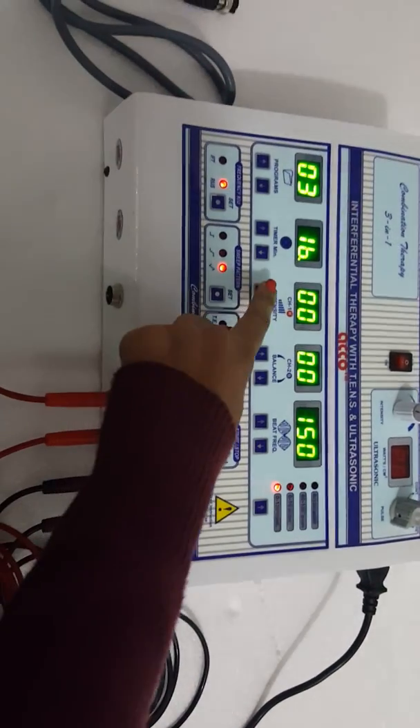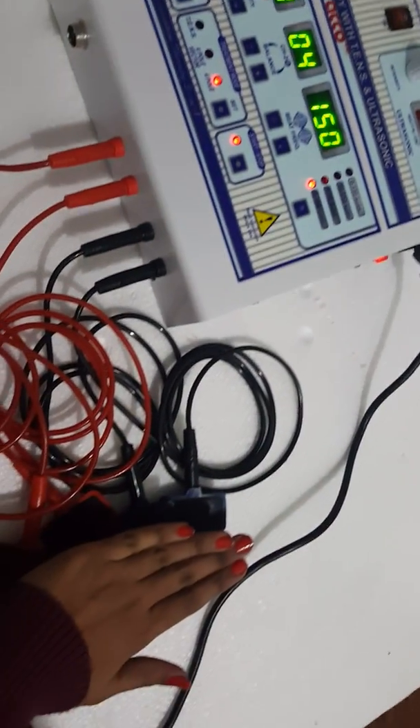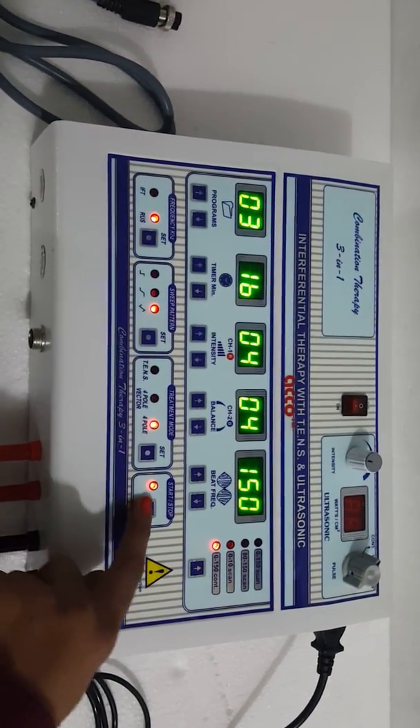Now increase the intensity as per your need. After treatment is completed, press the stop button.